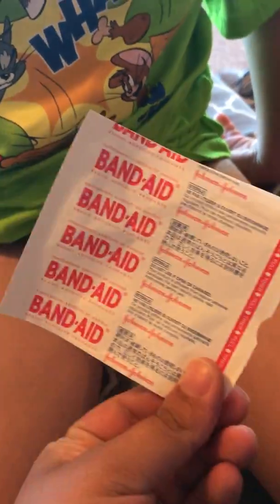We try to get him into the shower when we're going to change his sensor, but to make sure that this is clean, if it's not clean, then you're going to use an alcohol pad. We found the best success with his leg is when we put it higher up. So this is first the Tough Pad. This is the Tough Pad Band-Aid.